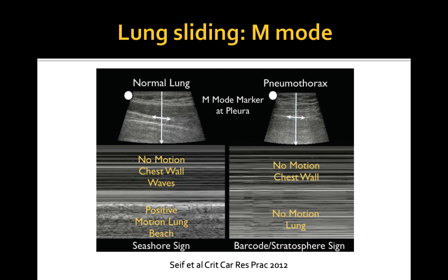This is a direct comparison of normal lung with the seashore sign on M-mode versus pneumothorax with a barcode sign on the image to the right.